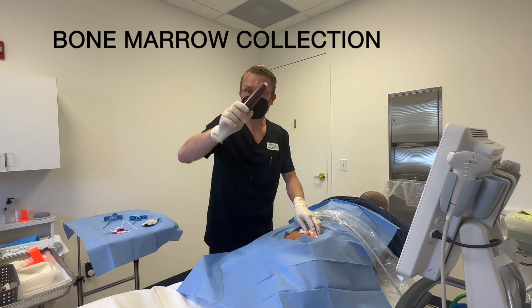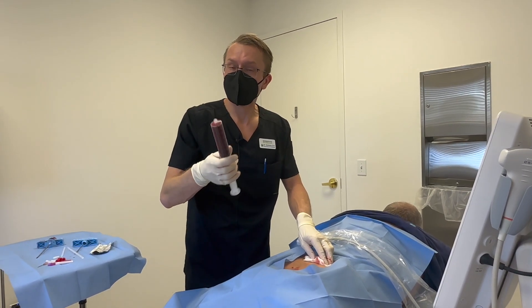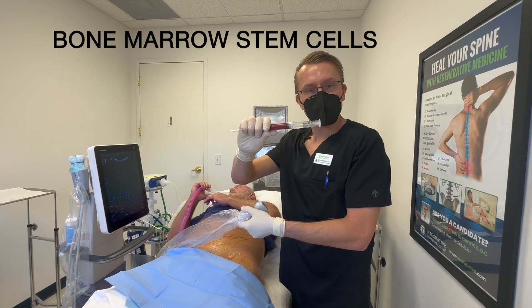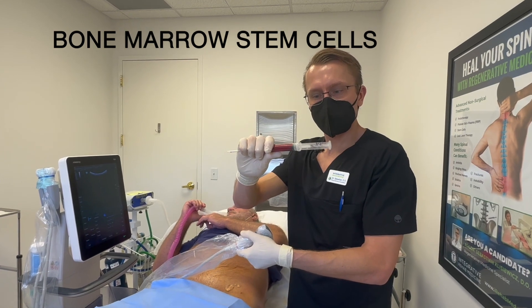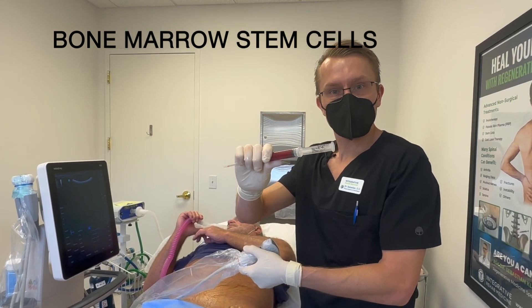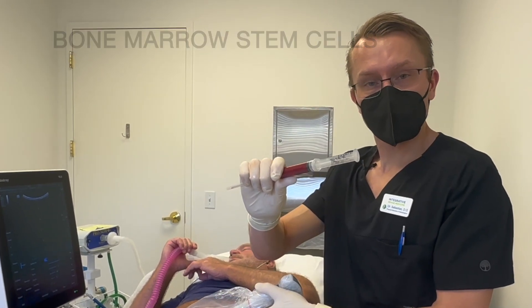Here's all the bone marrow product in this big syringe. We're going to go ahead and take it to our lab, process it, and then we'll inject it into his hip. This is the bone marrow concentrate that we've taken from Mark's pelvis. It's a little bit of a mix of bone marrow plus some platelets, and we're going to inject this into his hip to start the healing process.